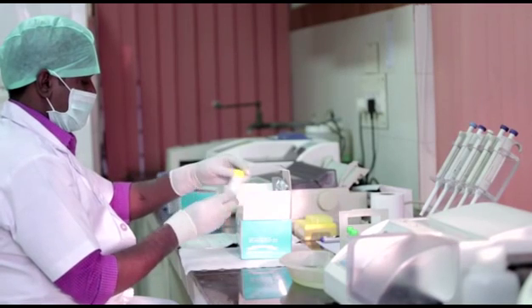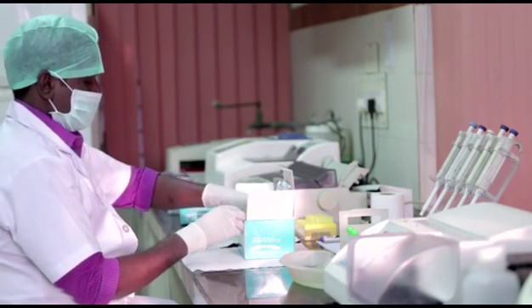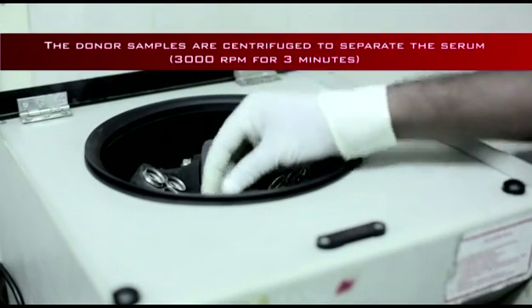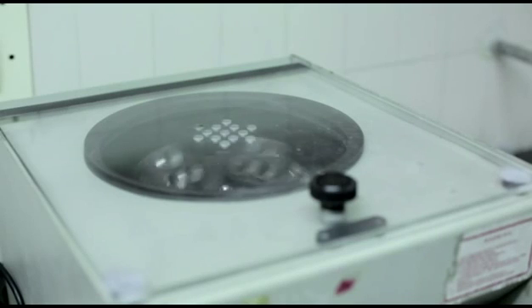Always adhere to manufacturer's instructions. Test kits, reagents and samples are brought to room temperature. The donor samples are centrifuged to separate the serum, 3000 rpm for 3 minutes.